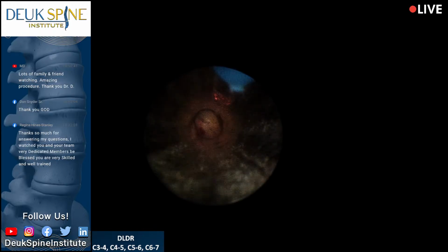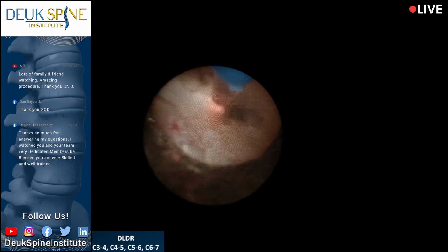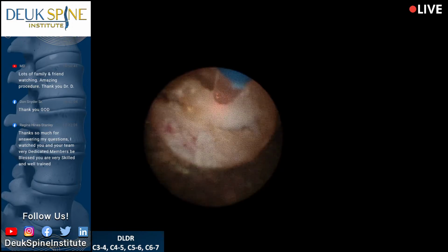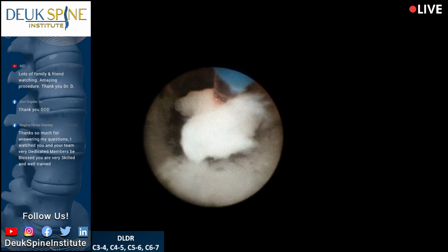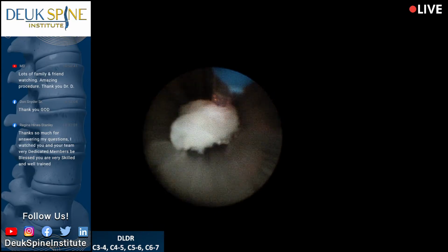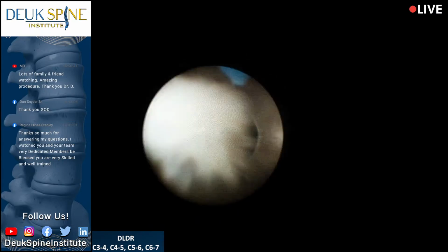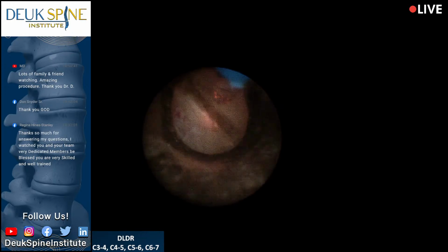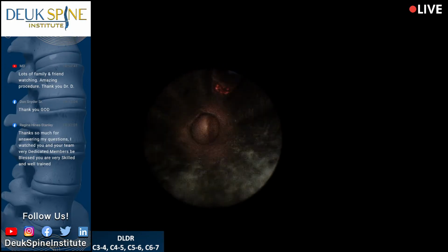So these are all bigger herniations. They're just small pieces of a bigger herniation that can't fit out the tube, and you can see how smooth their surfaces are. Remember what a herniated disc looks like when it's fresh. It's got all that irregularity to the surface. And now these are super smooth, right? They're smooth because they've been worked over like a river stone by inflammation.